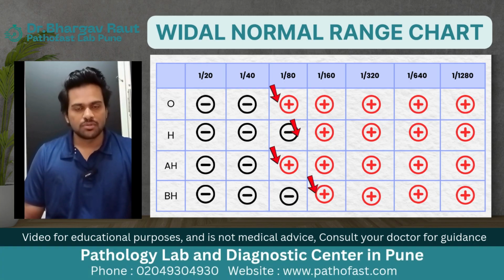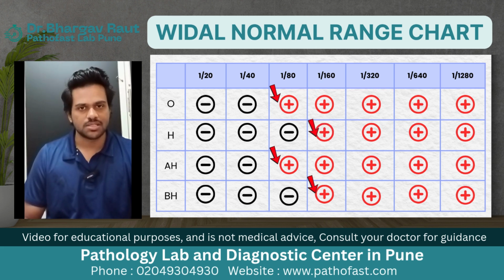Hi, I'm Dr. Bhargav Raut from Pathofast Lab, Pune, and I'm a pathologist with more than 10 years of experience reporting different types of tests, including the Widal test. Today, I'm going to explain to you how to read the normal range of the typhoid test.